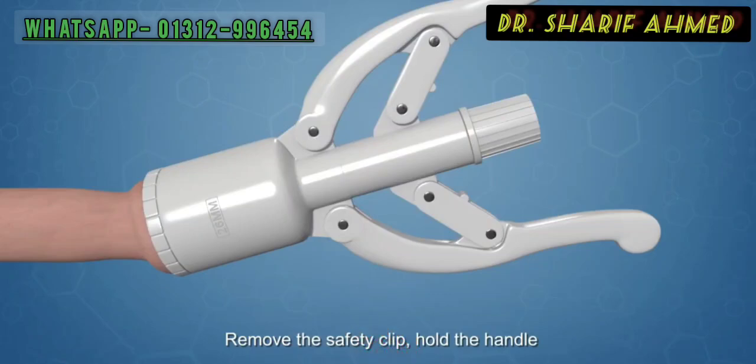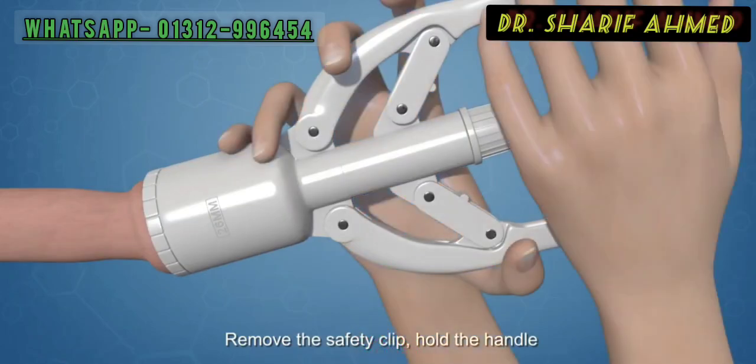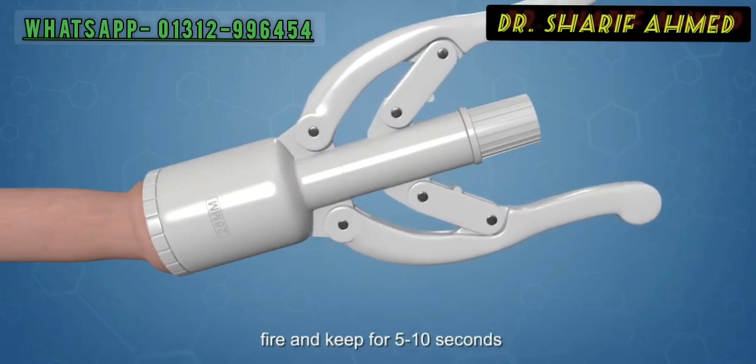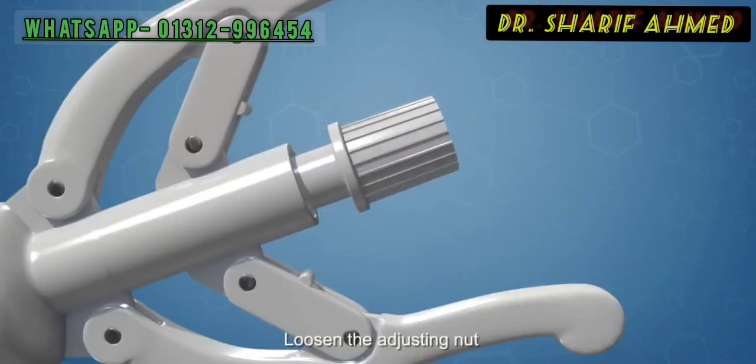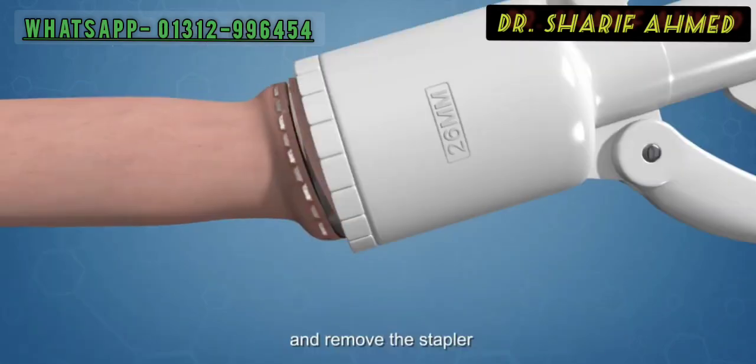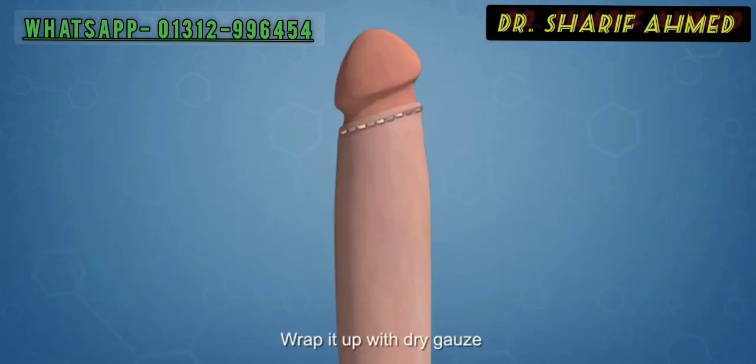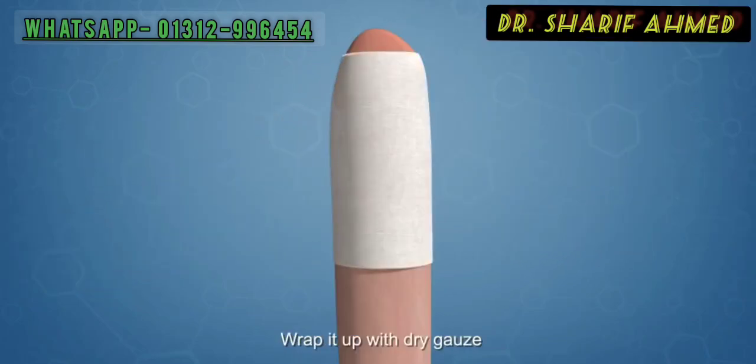Remove the safety clip. Hold the handle. Fire and keep for 5-10 seconds. Loosen the adjusting nut and remove the stapler. Wrap it up with dry gauze and bind up properly with elastic.